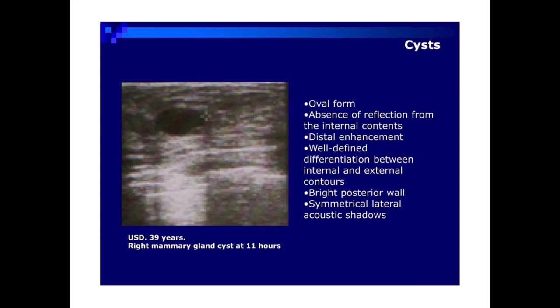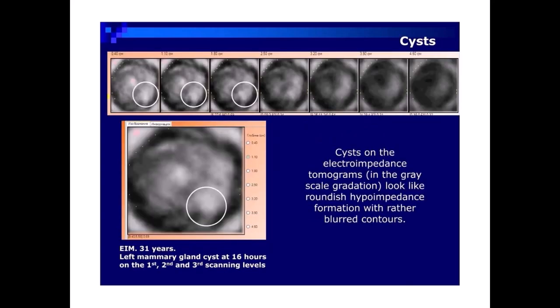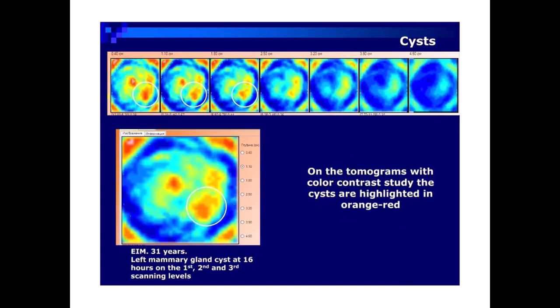Ultrasound example: 39 years, right mammary gland cyst at 11 hours. On electroimpedance tomograms in grayscale gradation, cysts look like roundish hypo-impedance formations with rather blurred contours. EIM example: 31 years, left mammary gland cyst at 16 hours, shown on the first, second, and third scanning levels.